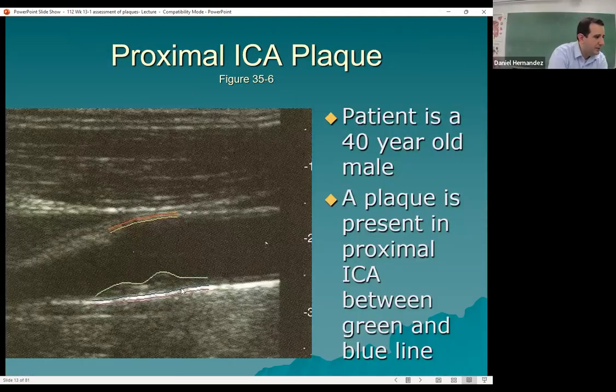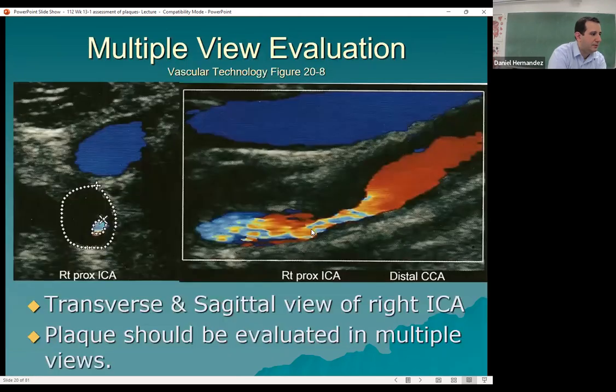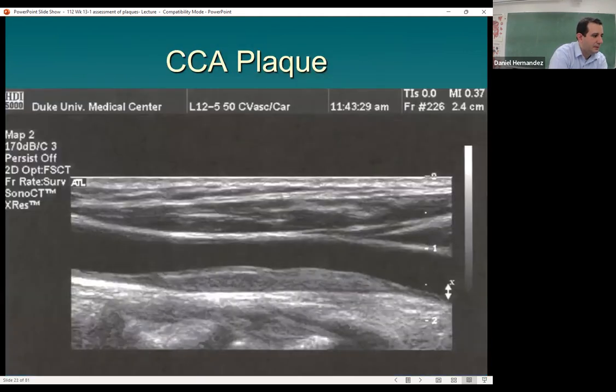So when we get into actual plaque formation, we start getting fat deposits within the plaque itself. Before this plaque progresses, it'll sometimes transition from some of these smooth plaques, where in between the layers we have what's called a fatty streak or a fatty deposit.